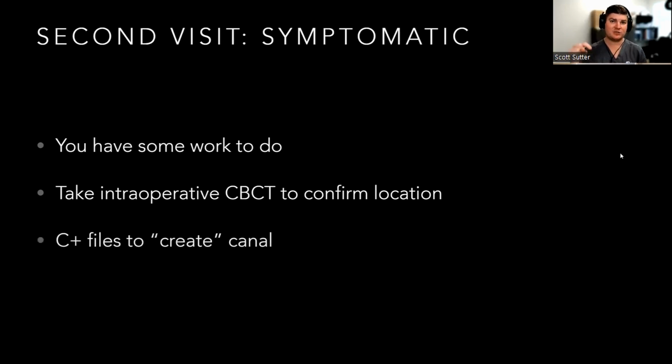C+ files can almost create a canal. This is very useful in straight cases, a little bit more complicated in curvy cases, but you can pre-bend them with curves. And then if they're still symptomatic and you don't think it's going to heal, I would talk to them about the apico at that point.